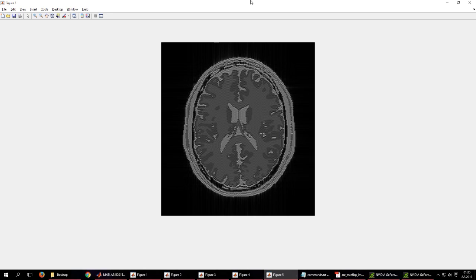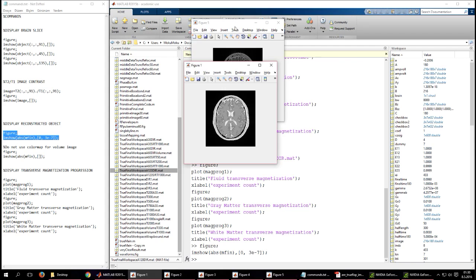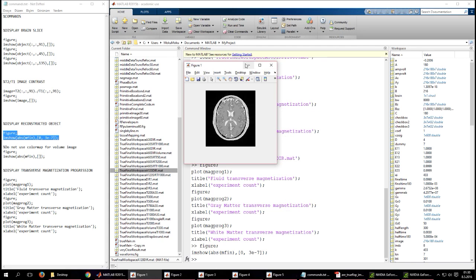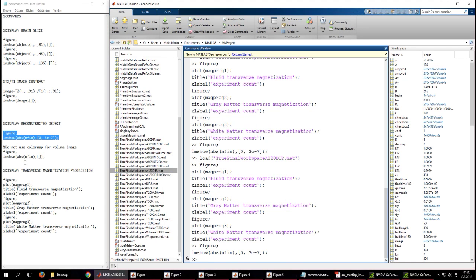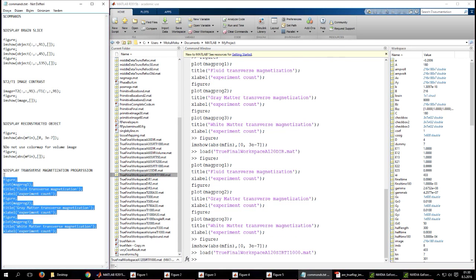By the way, I want to say that I did not demodulate the received signal to acquire the baseband signal, because the magnetizations computed in the simulation are always in the rotating frame, and the rotating frame's connection to the lab frame is the same as the connection of baseband signal and the received signal, so demodulation is not necessary.